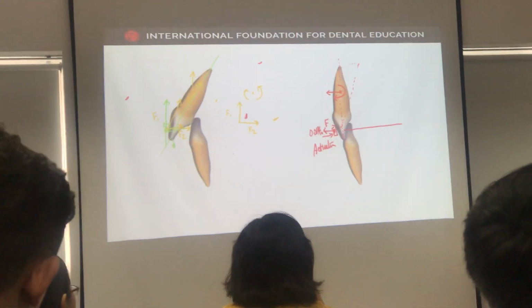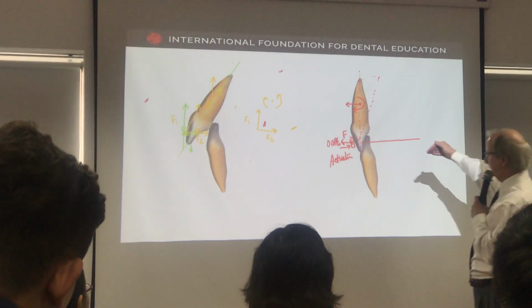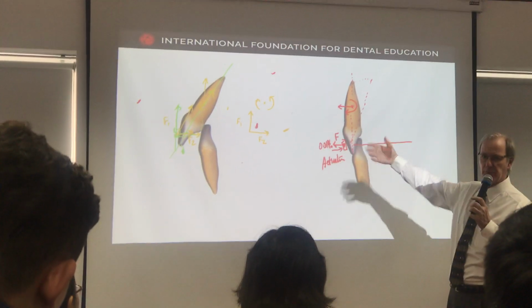So basically, by saving half an hour to bend wires, you lost a year of treatment for your patient.